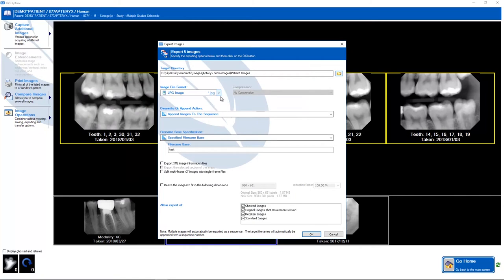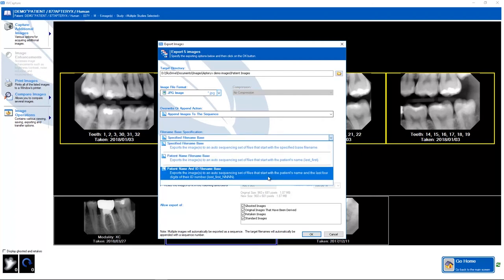From there, I can also change my file format. JPEG is the default as it's the most common. I can also change my file name. Often it will default to patient name and ID, which will give the patient format that you see here: last, underscore, first, underscore, the last four digits of their ID.